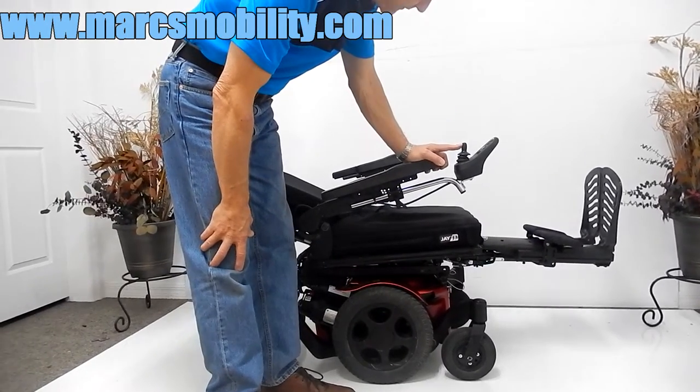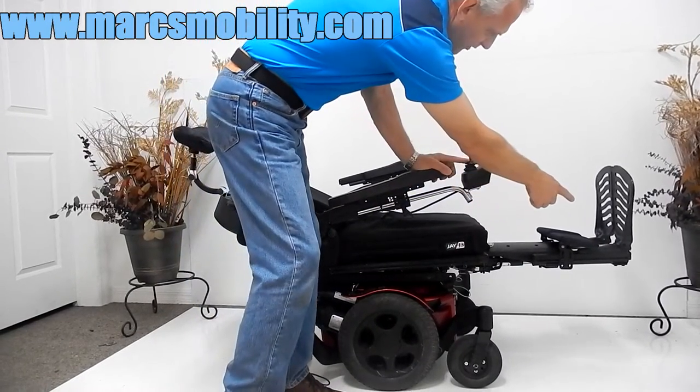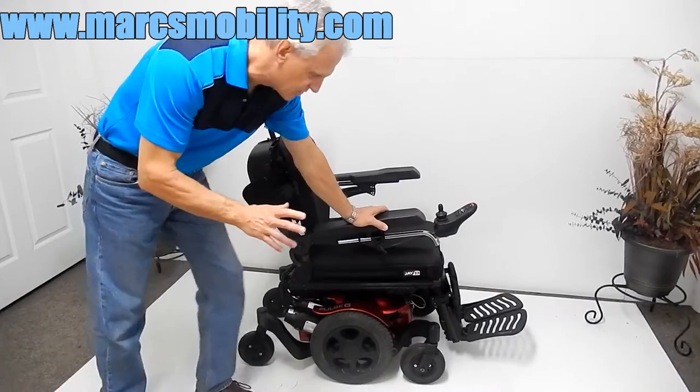You're pretty much laying flat right there. The legs do move forward — as you can see they're moving forward. If you need more length on your legs, there are six wheels on the ground, solid wheels, and very good suspension on this chair.